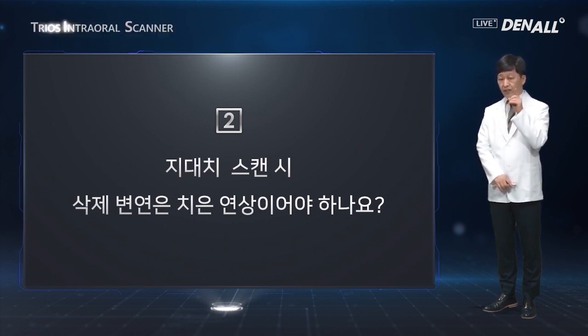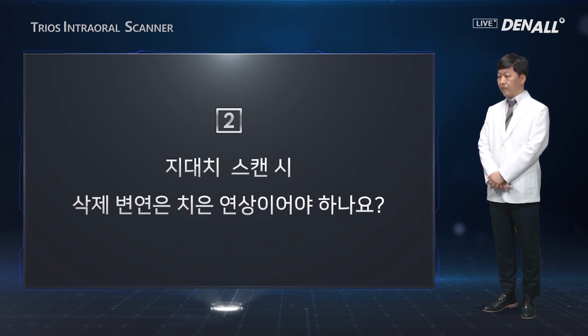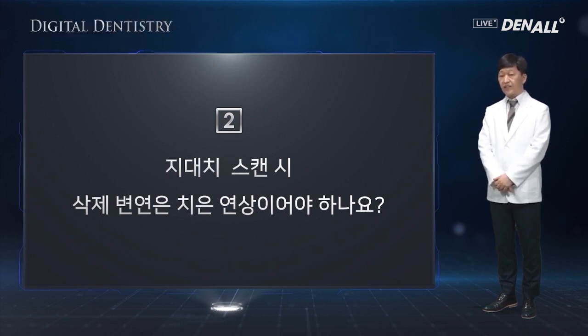As long as the margin is dry and is visible, the margin can be accurately read. So it doesn't have to be supragingiva margin. So this question is irrelevant. Among the scanners, especially Trios 3 or Trios 4, can accommodate submargin as well.